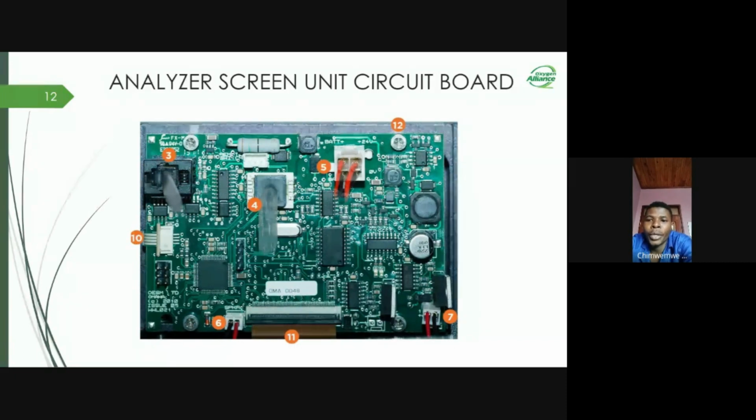There's also a speaker unit connected to part 6 via a cable. You can see it in the graphics. There's also a touch screen unit connected to the board via a cable, connected to part 10. There is a display unit connected to part 11 via a cable as well. And also we have the power supply from the 12 volt backup battery connected to part 5. And there is also the nitrous oxide cutoff solenoid valve assembly unit, which is connected to part 7.